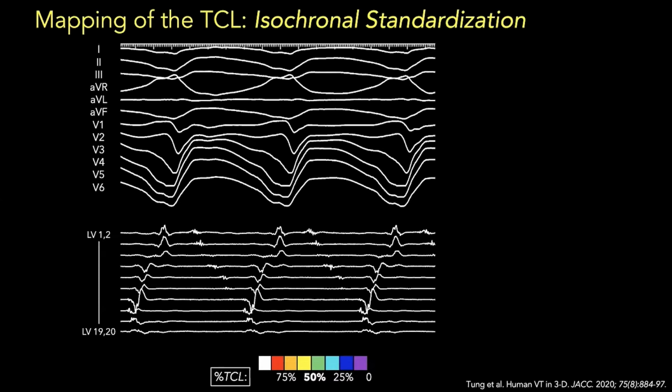Here you can see with this example, with a linear catheter, we have every millisecond of diastole in the isthmus mapped from the early diastole to late presystolic activation. Whenever we map VT, we try to propose an isochronal standardization where the window starts at the QRS onset. Therefore, you always have the same color scheme in which purple meets white is where your QRS breakout is.